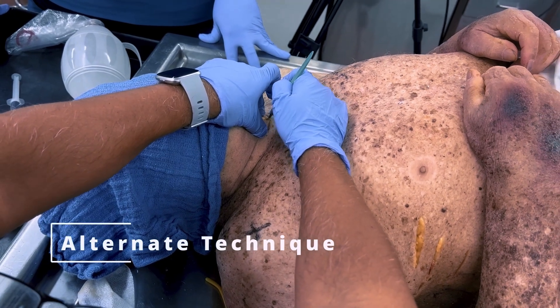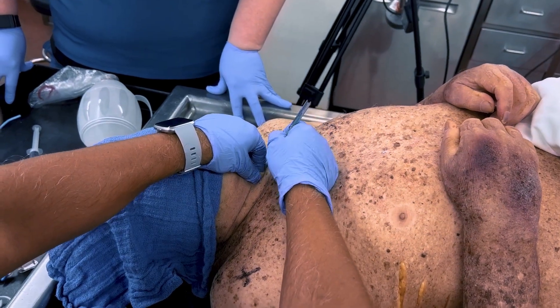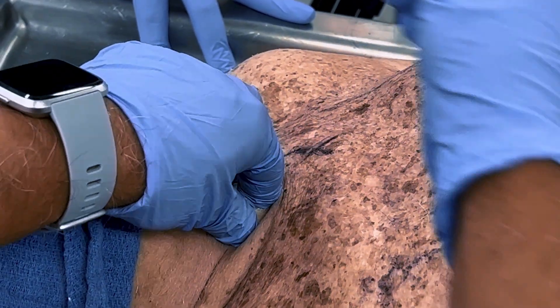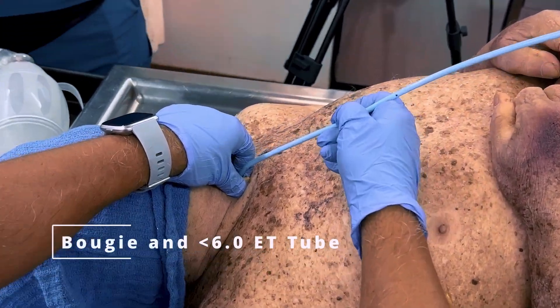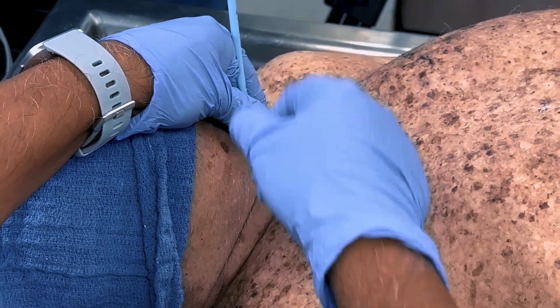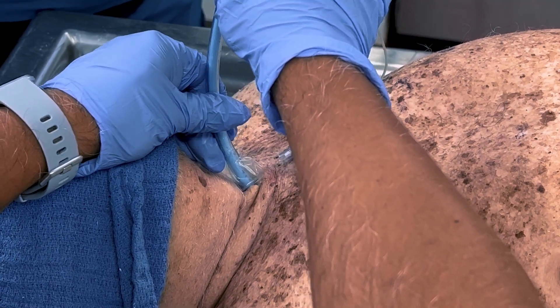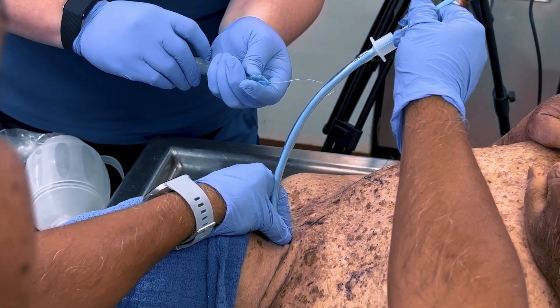An alternate technique and equipment can be substituted. When using the green number 10 scalpel blade and after the horizontal incision of the cricothyroid membrane is performed, engage the safety mechanism of the blade and use the dull end to confirm and widen the opening of the cricothyroid membrane. If a tracheostomy kit is unavailable, use an adult size endotracheal introducer bougie and a cuffed ET tube no larger than a 6.0. Insert the cuffed ET tube just beyond the cricothyroid membrane, then inflate.